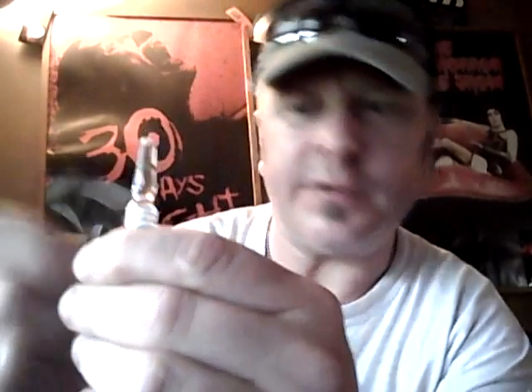So I'm going to go through a little bit more about how to do it and how to prepare it. I basically have to get the ampule here. I have to open up these ampules. They got a little green line where you're supposed to put a thumb. You're supposed to put your other thumb down here. Look at a different video online if you need to open up one of these. If you have a vial, totally different story. And it has a little blue dot, which I guess you can't really see right there. And that's where you're supposed to put your thumb, because right underneath the blue dot on the neck here is a little score.